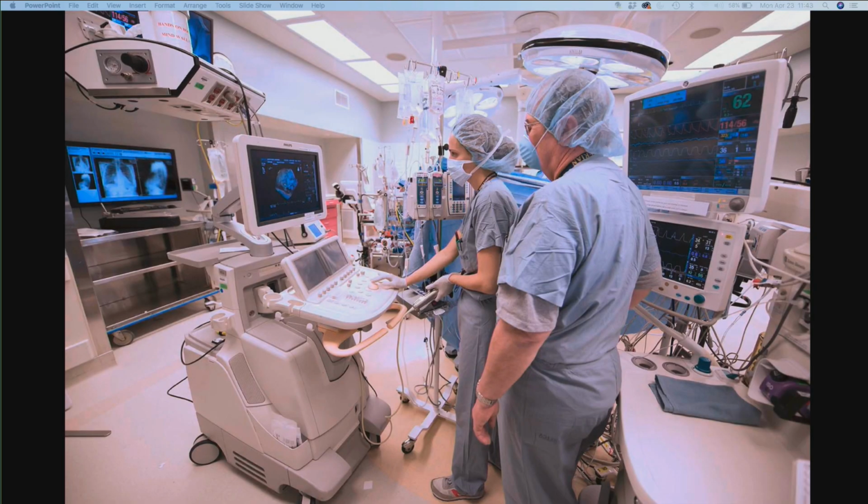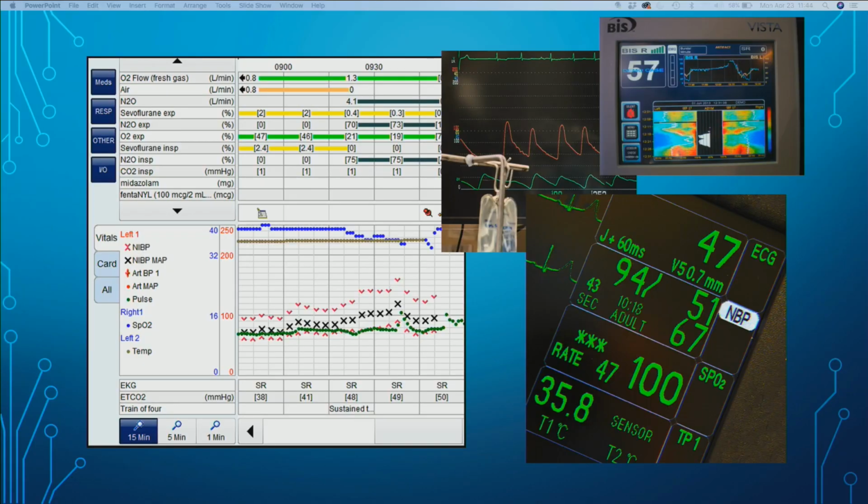This is the other end of that same room, and it's 2 of our cardiac anesthesiologists, Gabriella and John Fox, here at the head of the bed, and they're doing transesophageal echocardiography. So we use real-time imaging to help guide some of our decisions. So imaging comes into it as well as all of this raft of physiologic data. You can see to the right the panel of monitors, in the background those infusion pumps. In this, we have a very complex array of data that we're dealing with.